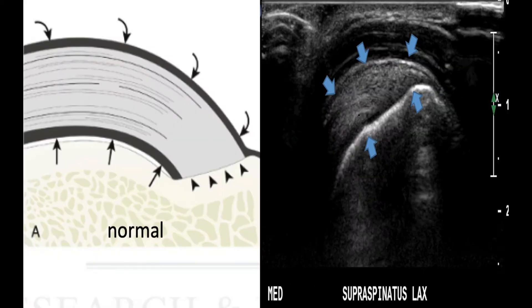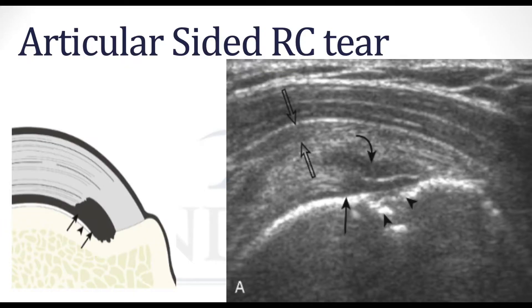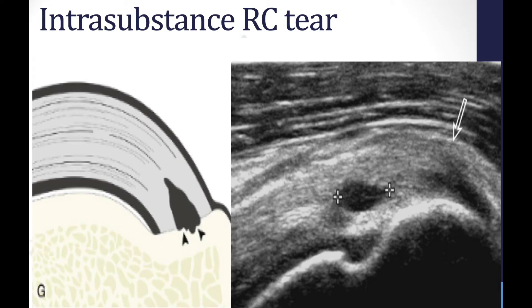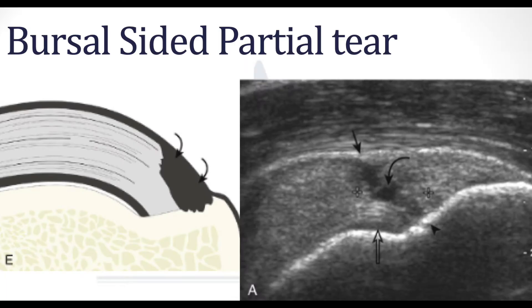Now let's see what happens when we start having problems. In an articular-sided tear, we could clearly see the problem where the tendon is torn. Let's look at an intra-substance tear where the problem is inside the actual tendon. And a bursal-sided tear is where the torn tissue is on the top.